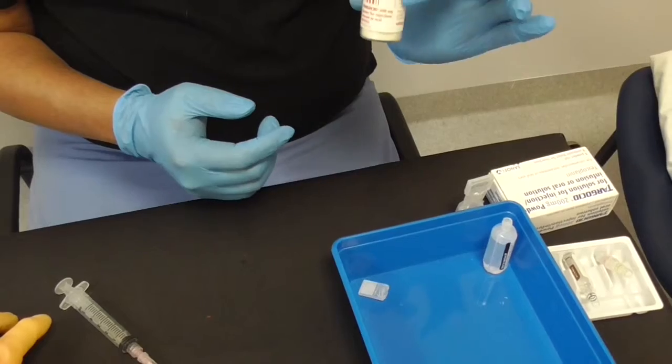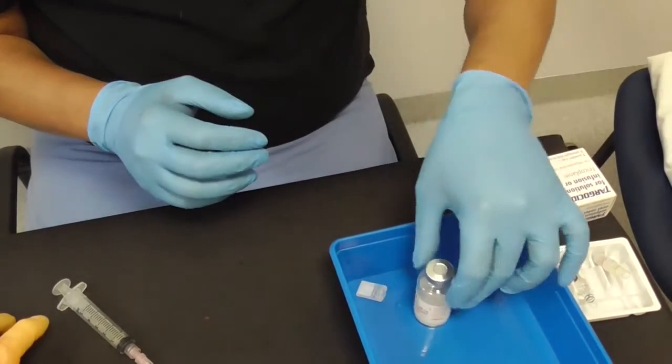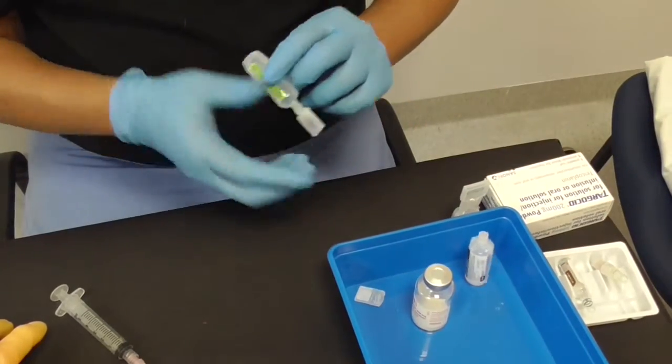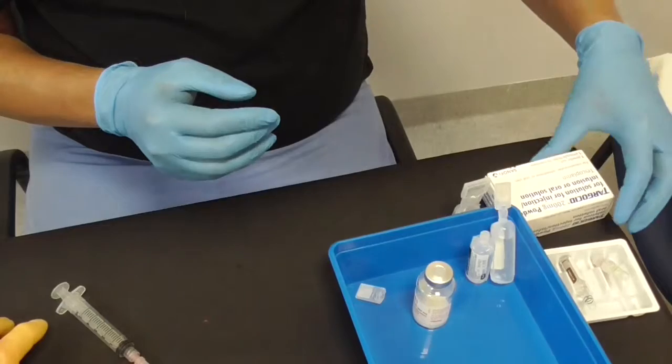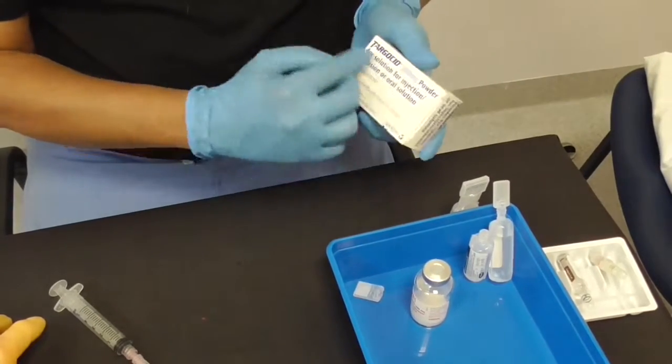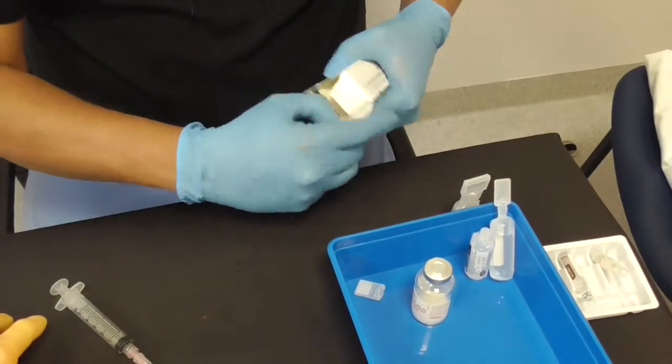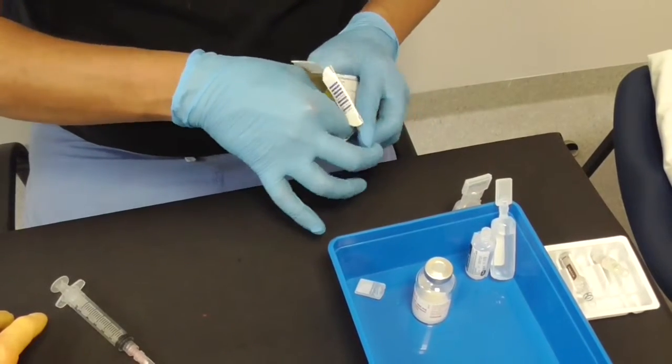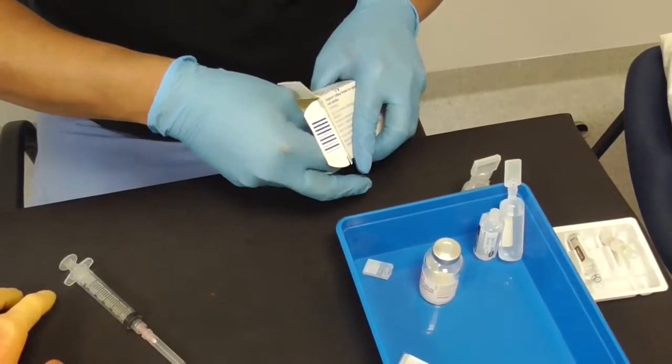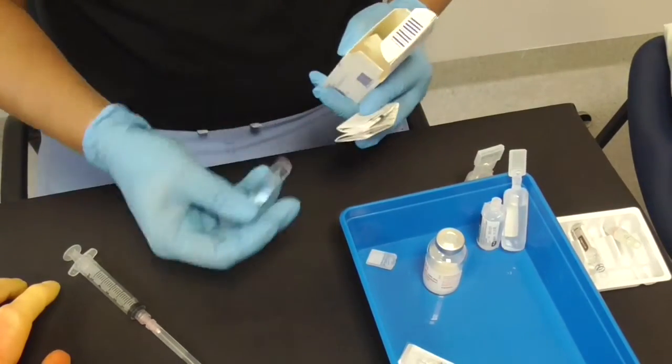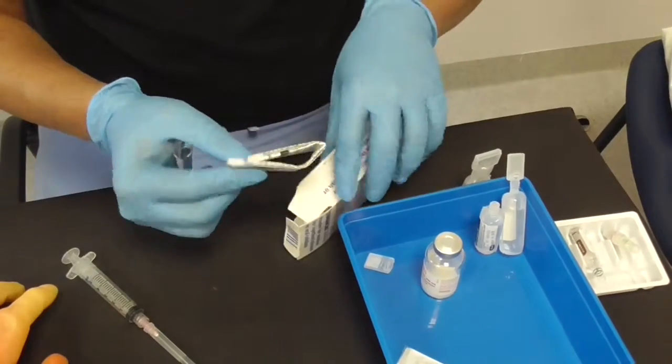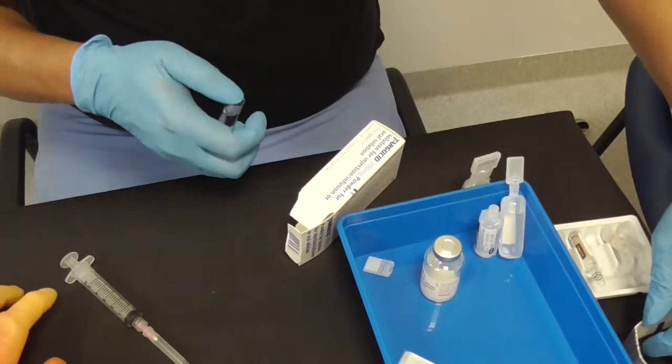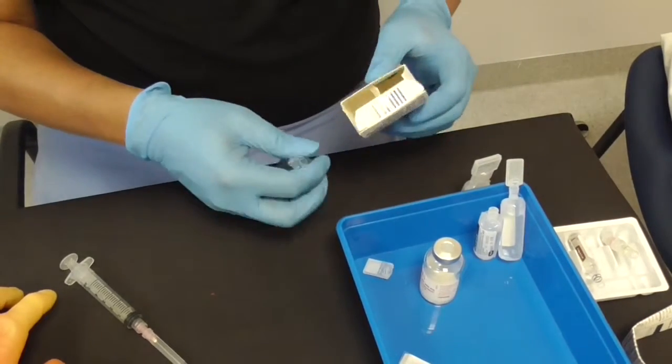Important: before you add the liquid, you've got to know what you're going to add. You can add either water for injection or saline. It's important that you add the correct thing. When you get a packet like this, which is Targocid, open it. If you're not familiar with it, there will always be a little leaflet. There you go. And this one has its own diluent. But the leaflet will actually tell you which solution you use to dissolve it, and how much.